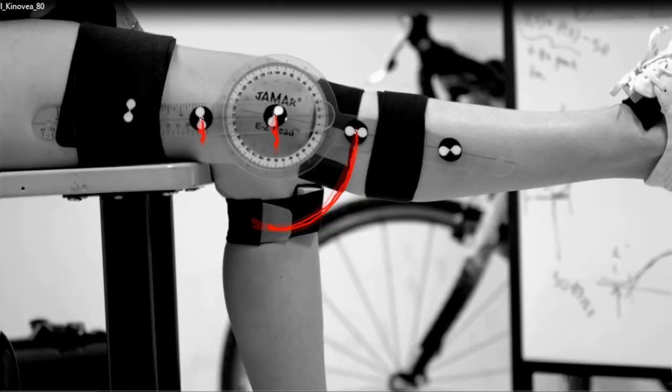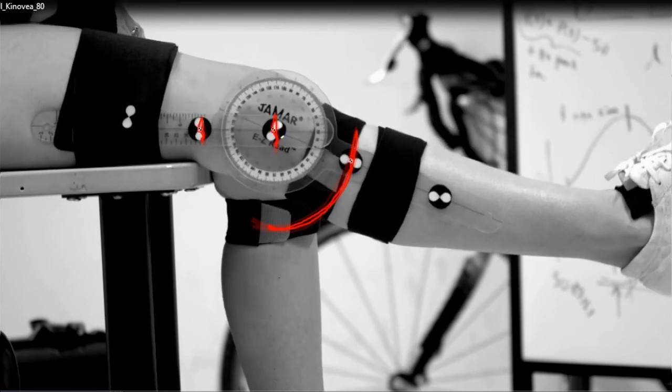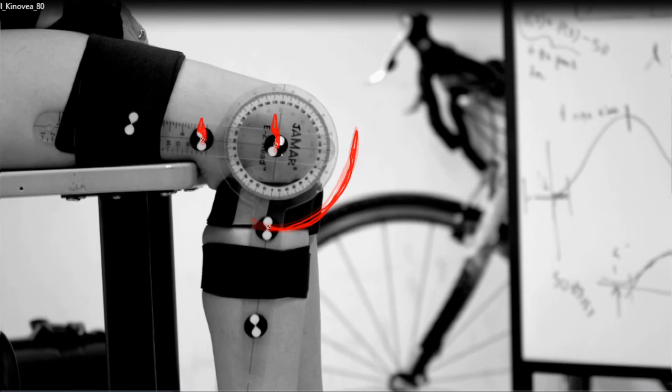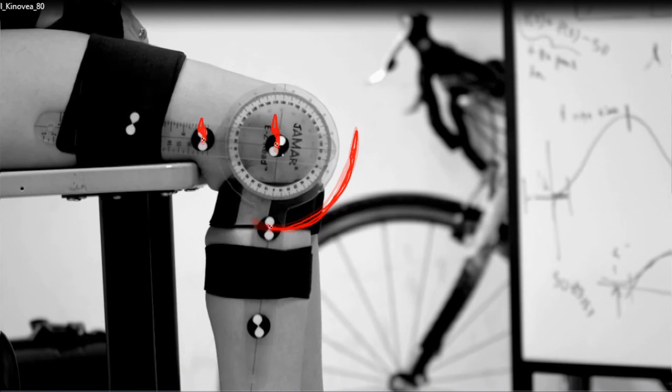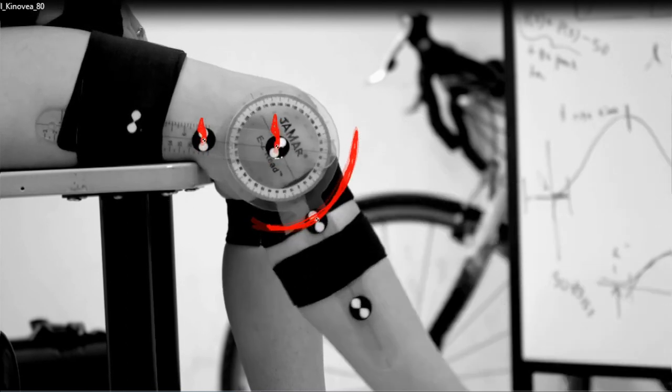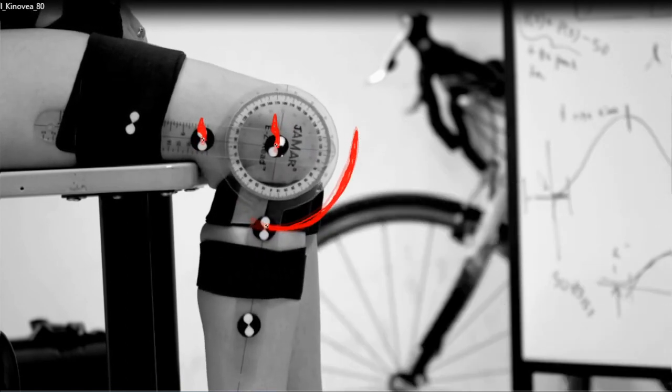Each recording started with the knee at full extension defined as zero degrees. The knee then bent to 90 degrees flexion and back up. This motion was repeated at three speeds: 40 beats per minute to simulate walking, 120 beats per minute to simulate running, and in between at 80 beats per minute.